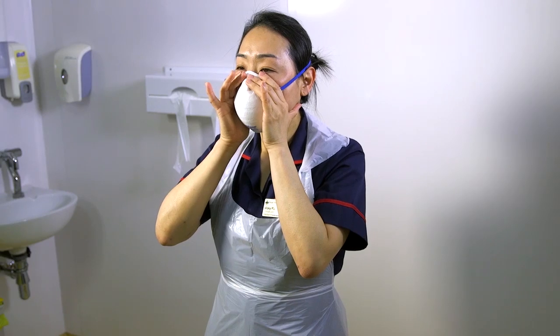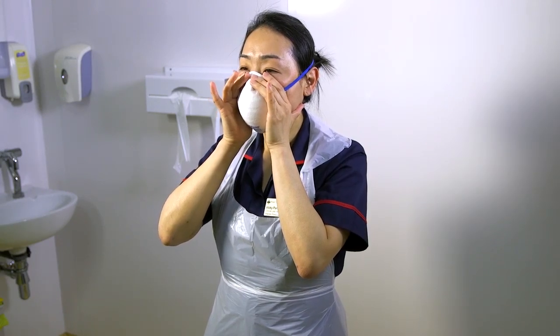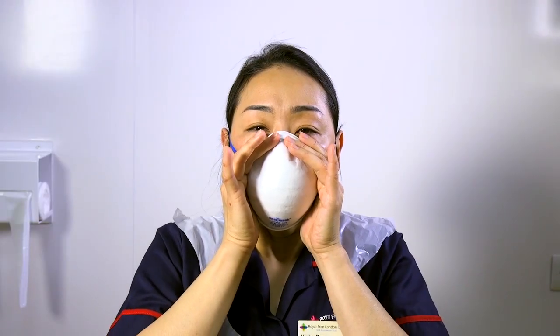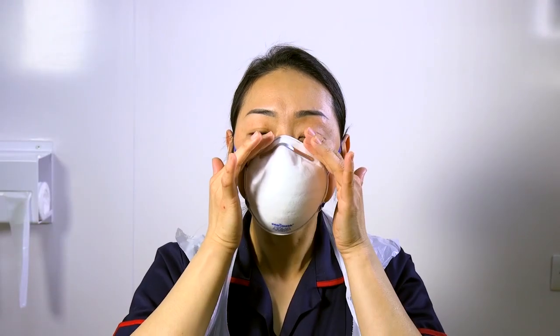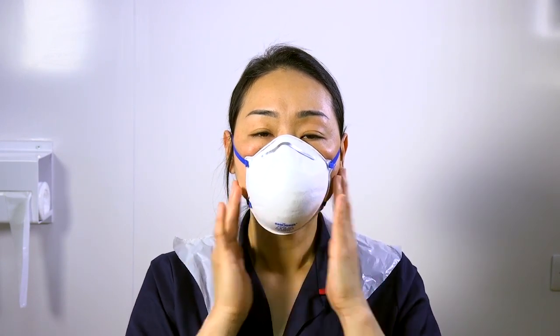Hold the mask in position. For a non-valved respirator mask, take a sharp breath out to ensure there is no leakage around the edges. For a valved respirator, take a sharp breath in to ensure there is no leakage around the respirator mask.